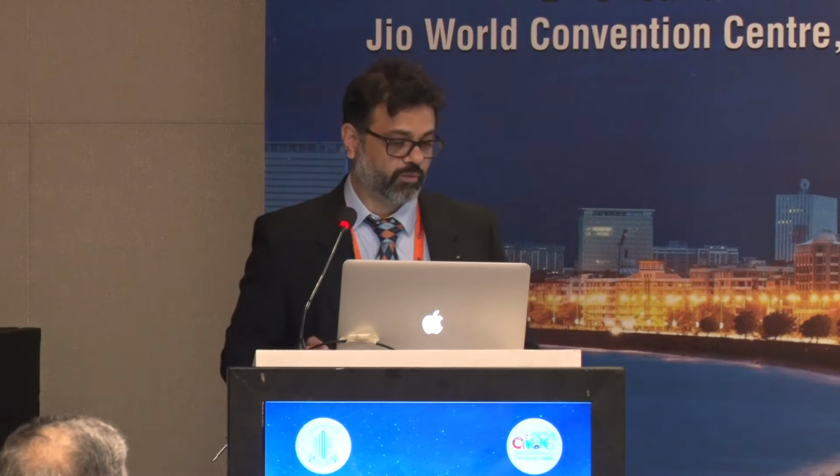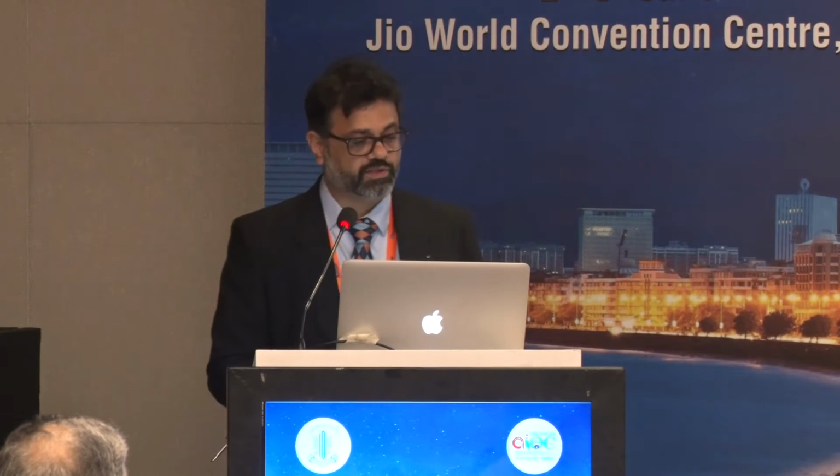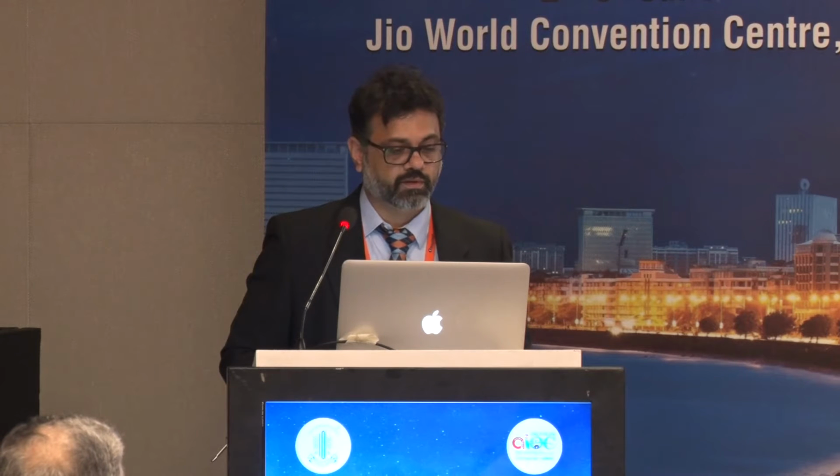So this is one of my fellows who's doing it, and I thought, okay, no, let me take over, and this is what I have done, not the fellow. And I have a rent out there, and I don't know how big. So I use a dispersive viscoelastic without shutting off the irrigation, and now assess the situation. My CCC is intact, that's for sure.